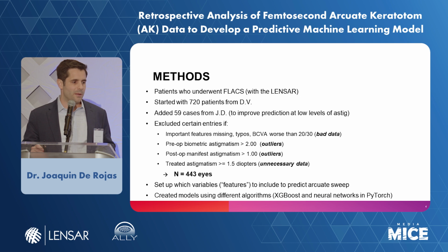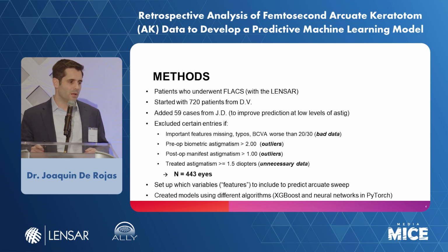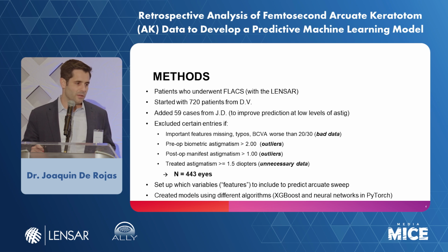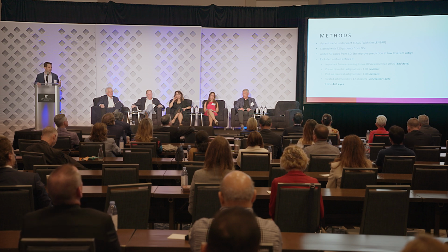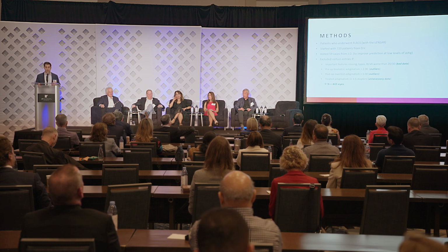So what we did is we started with some of Denise's data. We had over 700 patients that she offered, and it was great data. We started with that, and then we started paring it down a little bit, seeing some outliers, some incomplete data, patients that didn't have really great vision, which most of them did. We kept bringing it down, and then I also added a few of my own cases because she tended to do more paired incisions, and I wanted to see what happens with single incisions as well as another feature. So we got to a little bit over 400 eyes there.